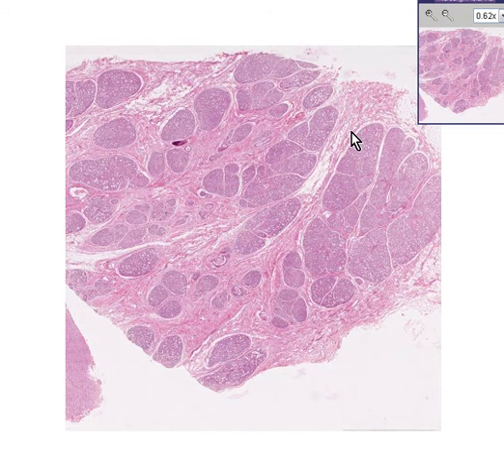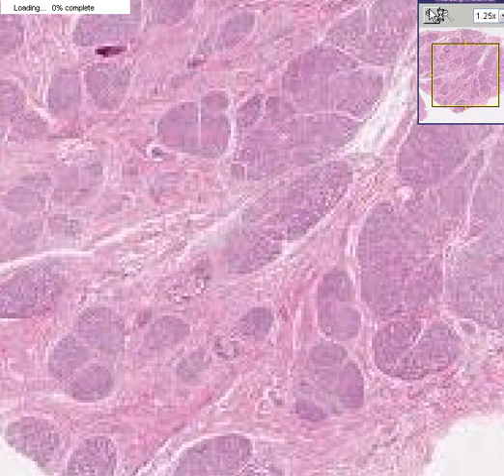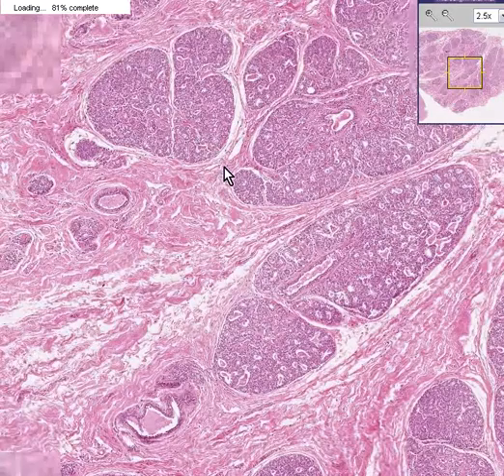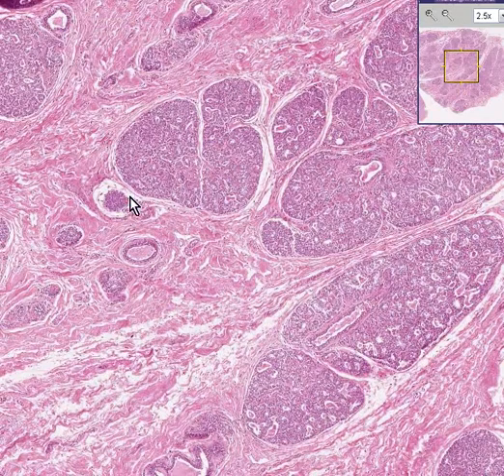In here, you can see the lobular areas are generally more common than the stromal areas. So let's say that this is 60 or 70%. Of course, in a lactating woman, it may be 90% glands and very, very little by way of stroma. So let's blow it up a little bit. And remember, these areas of glands, which are separated by relatively thin amounts of fibrous tissue, are called lobules.